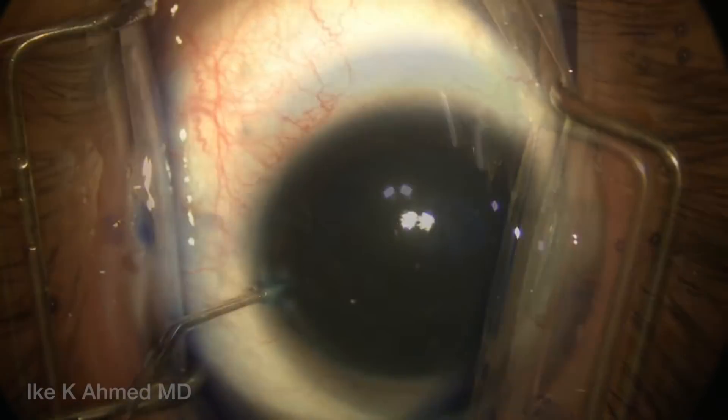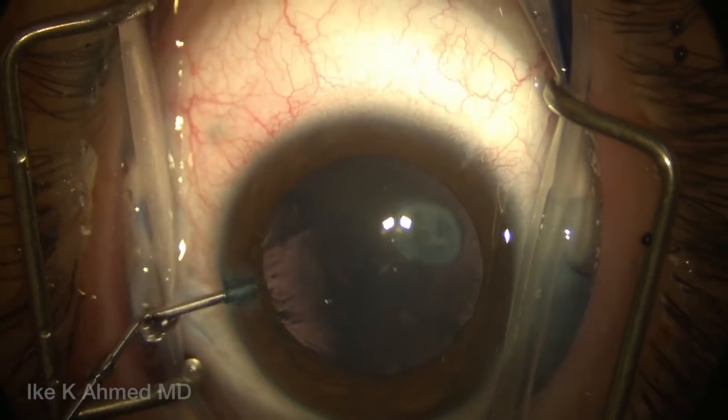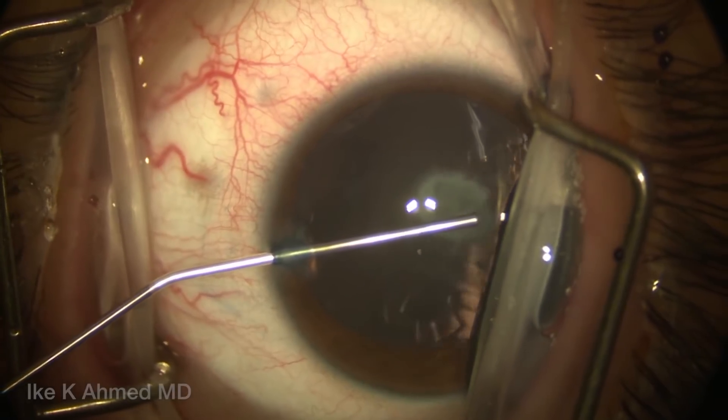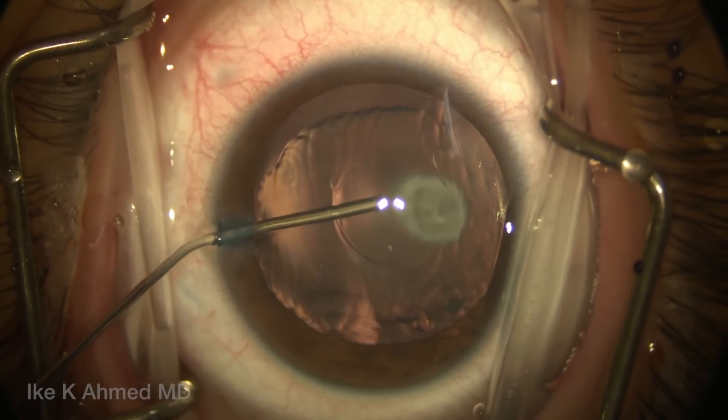We're going to inject some trypan blue, which I think helps not so much to visualize the capsule, but really can enhance and reduce some of the elasticity of the capsule to enable a more stiff capsulorhexis to help with these pediatric cataracts, and we use it routinely.